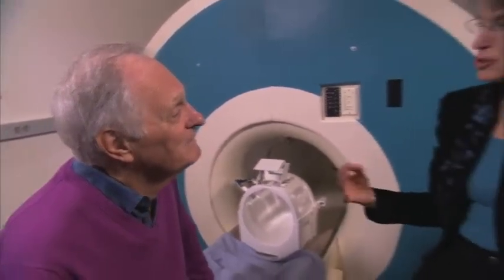Okay. It's true that we are disrupting the brain with magnetic and electric fields, but we're doing so in very subtle, small ways. And so I think the main reason to be reassured is that this method has been used for decades with no evidence of any problem. Animal safety studies have raised entire animals for their whole life while being scanned, with pregnant animals, rats raising pups inside a scanner with no problem.